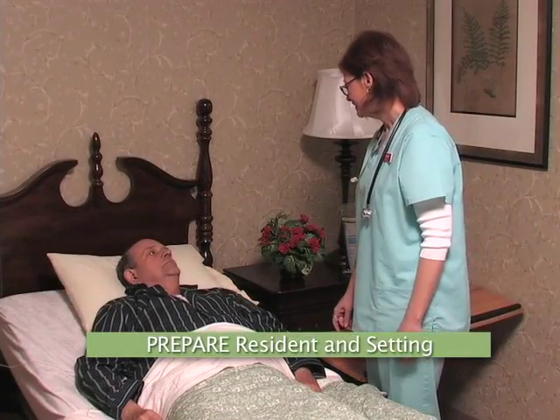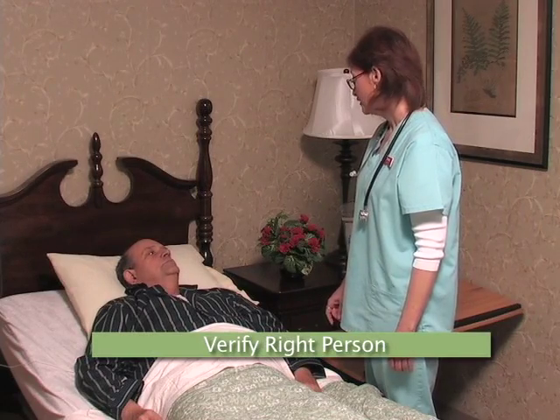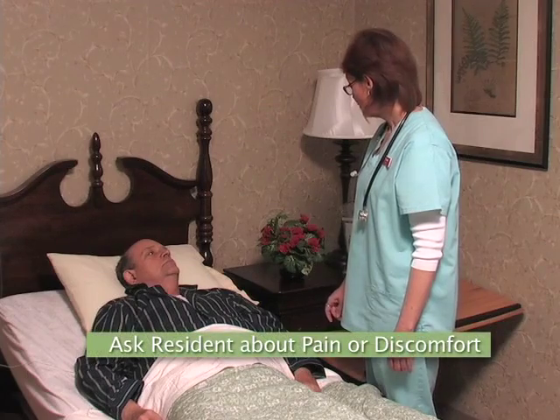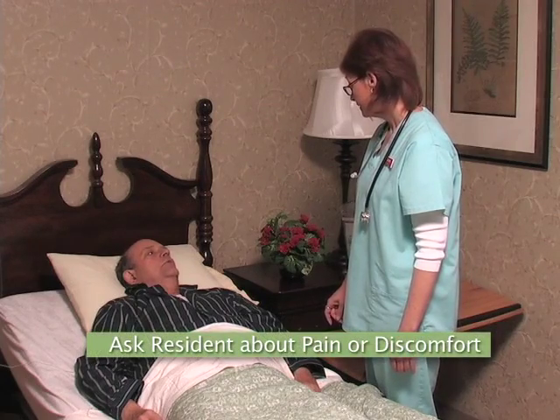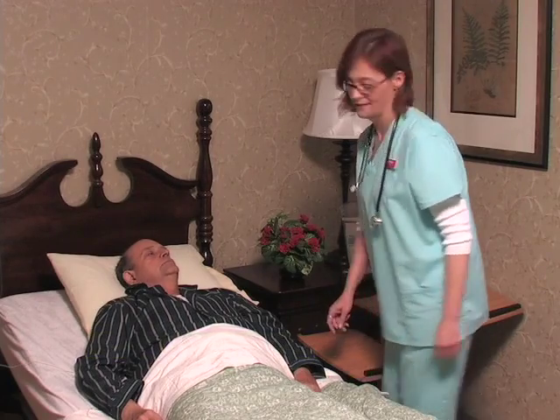Hi, Jerry. Good morning. Can you please verify your last name for me? Hansen. Thank you. Jerry, I'm going to be preparing your medications this morning. Do you think you may need anything for pain? I don't think so, thank you. Okay. I'm going to go ahead and get everything ready now. Okay.